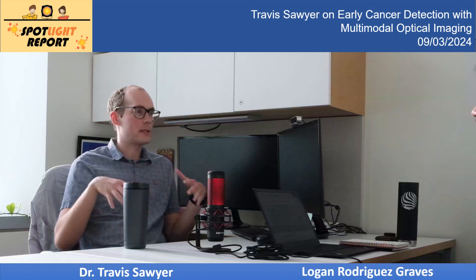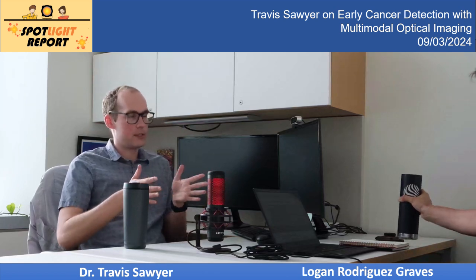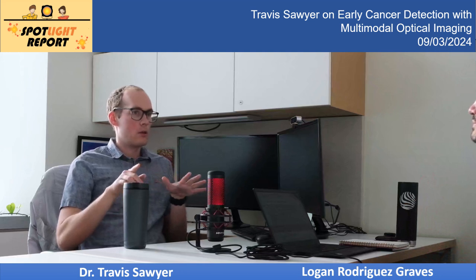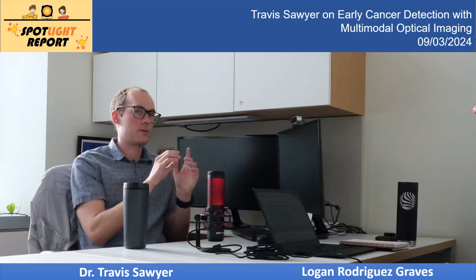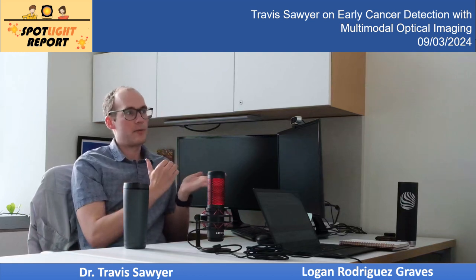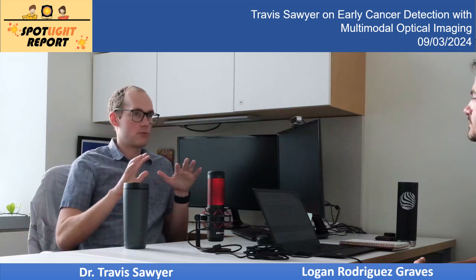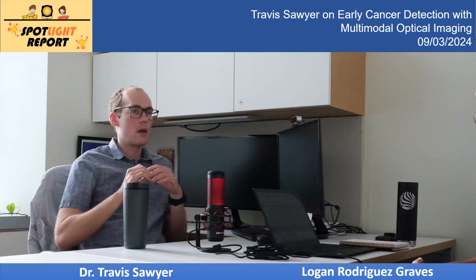Usually you scan point by point, and the secret sauce with OCT is that you have a relatively broad spectrum, meaning it's not a laser, but a 100 nanometer bandwidth source. If you take that light and disperse it to get a spectrum, and then take the Fourier transform of that, it actually gives you the depth profile of the interference, not just one single point in space. And so that makes it really nice to get 3D data, because you can just do a 2D scan and you get a 3D volume.